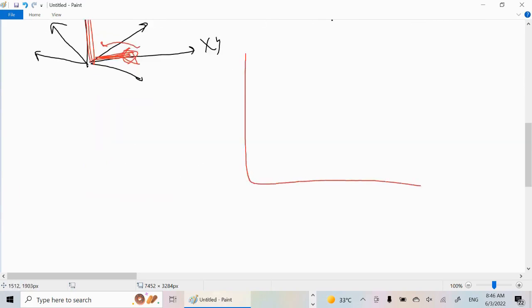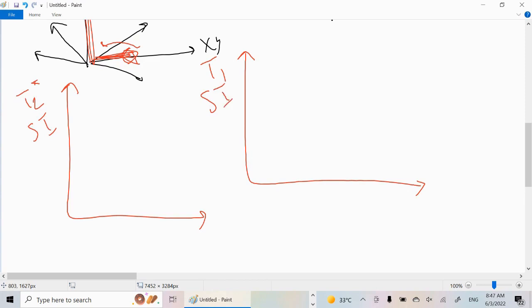If I am talking about the T1 sequence, when I take a T1 weighted image and a T2 star weighted image, I observe the change in signal intensity with my contrast agent. Let's assume I have this tissue without any contrast agent and the same tissue after applying the contrast agent.